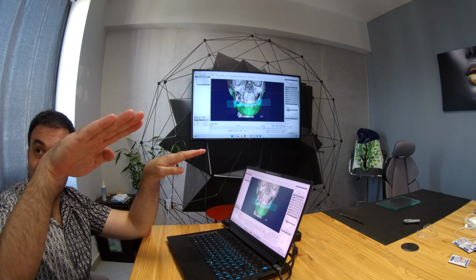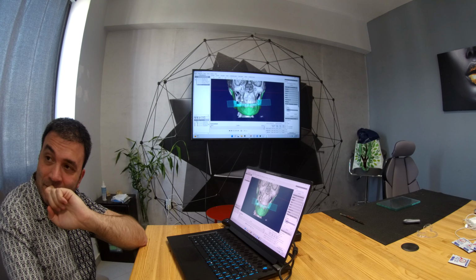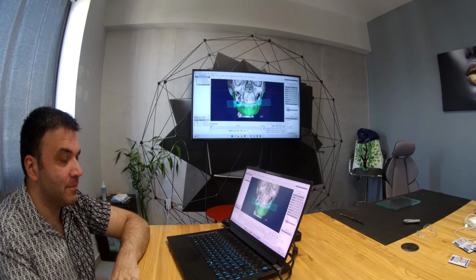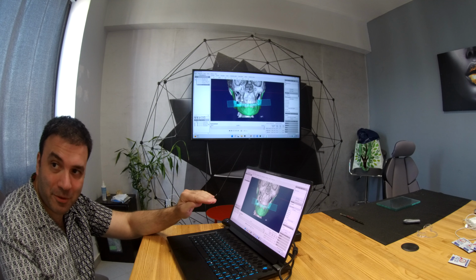You see this too? Yeah. But I don't think it's better. It's perfect. His occlusal plane is inclined. Yeah. But I did it not very well because I didn't use it with a fork. With a fork it will be 100% precise.